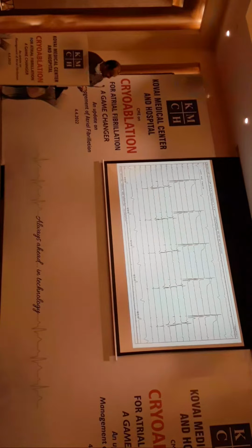You can see this is a catheter which is kept in the pulmonary vein. You can see here clearly some spiky potentials which follow this potential. This is a normal atrial electrogram. After the atrial electrogram, you can see spiky potentials here. These are the potentials which we call pulmonary vein potentials. These are the potentials which are arrhythmogenic and which connect into the atrium and create trouble for you, causing atrial fibrillation. So these are pulmonary vein potentials recorded from the catheter.